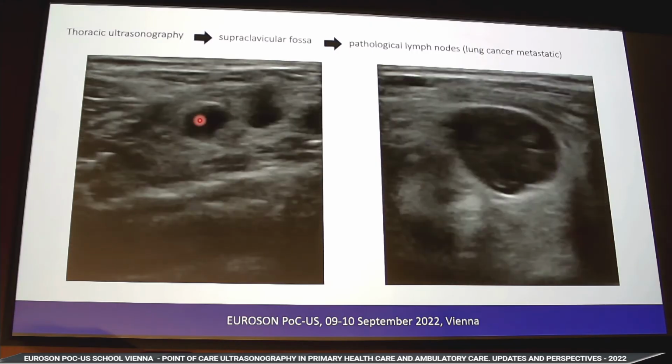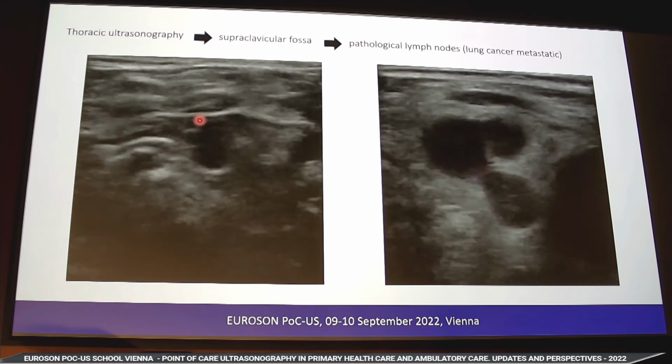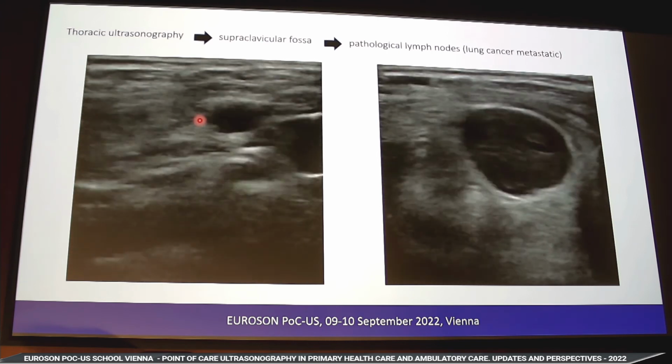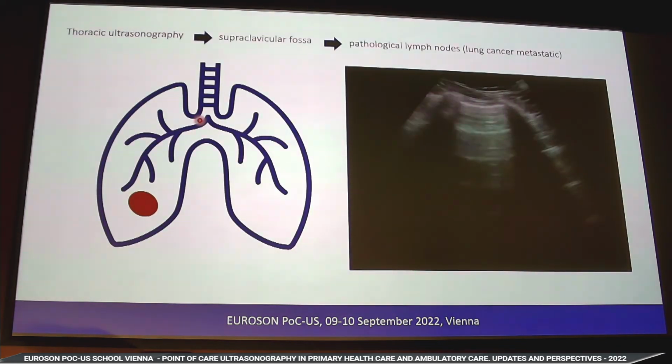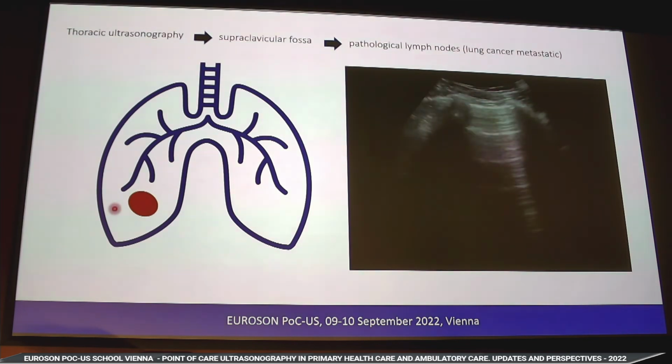It may happen that you have a patient like that who has, on the right-hand side, this is a lady, pathological lymph nodes. You look at those nodes, you know that those are pathological lymph nodes. But you examine the chest and the lung and you can see a proper image. And it may happen that such a person will have lung cancer, because lung cancer, if it does not change the sonographic image in the chest wall, will give you the proper image. That's why sonographic examination is not a screening examination for lung cancer.